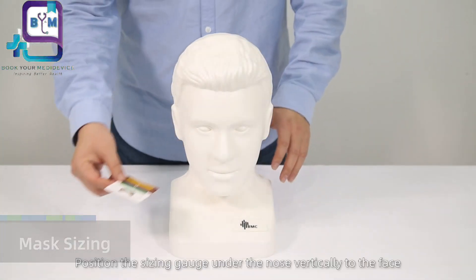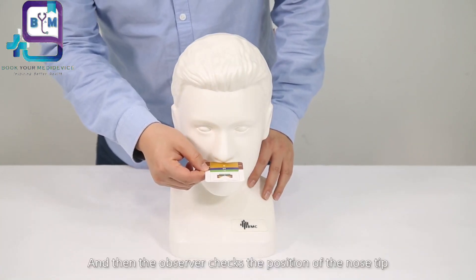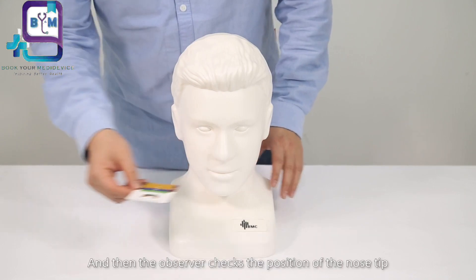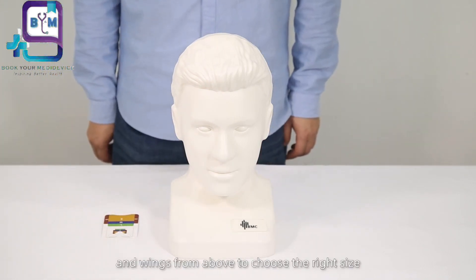Position the sizing gauge under the nose vertically to the face, and then the observer checks the position of the nose tip and wings from above to choose the right size.